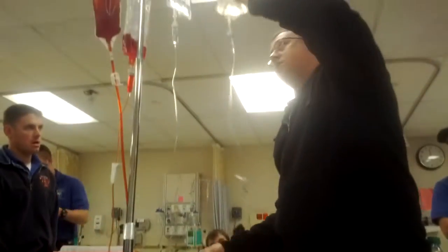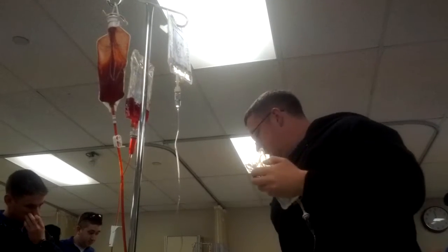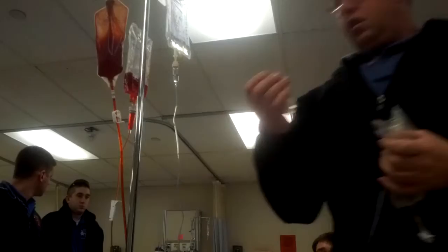We're just gonna go to the closest port from the top, and this just has to be higher than that - it'll be piggybacked. It just has to be a little bit higher so it'll come in there and run in.